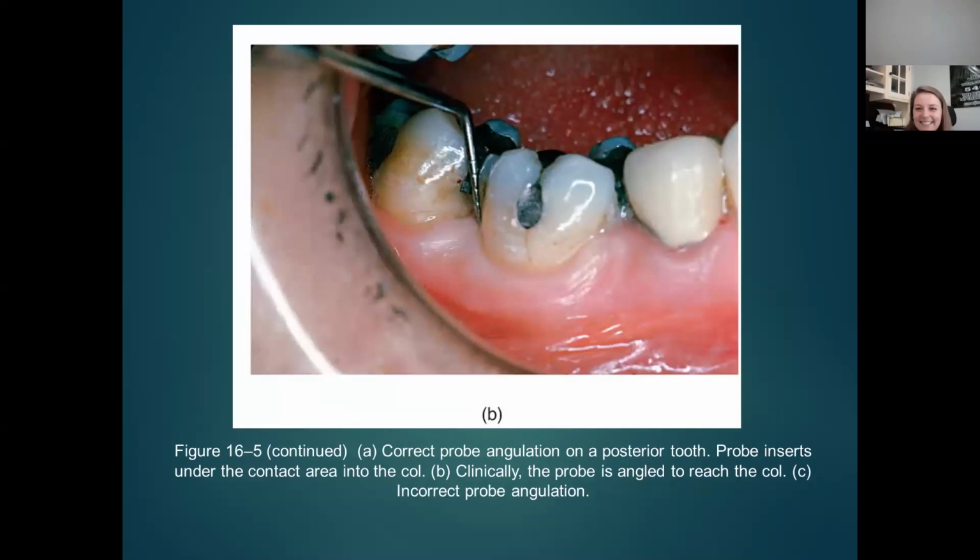This is a Williams marking probe, and they don't have any black lines on them. These are the type of probes that I had when I was a student, and oh boy, did that make it hard to read. So now you've got nice little black lines in there.